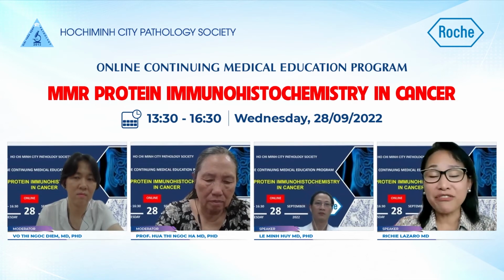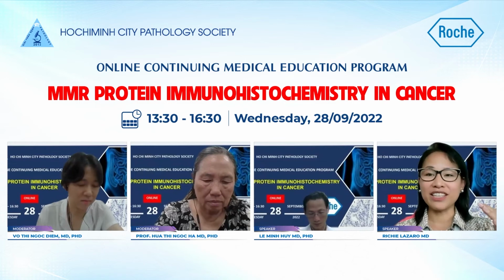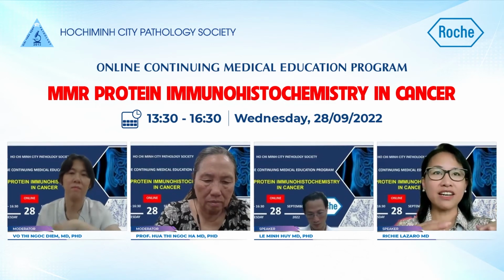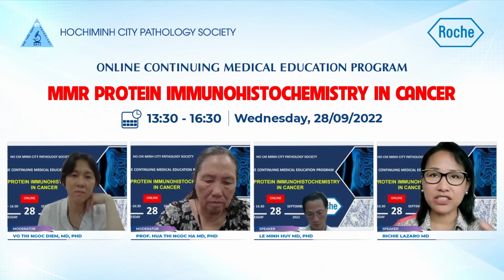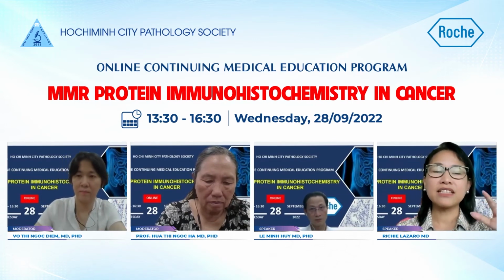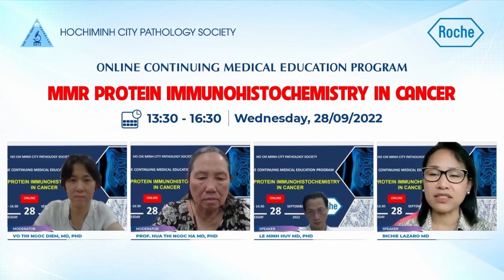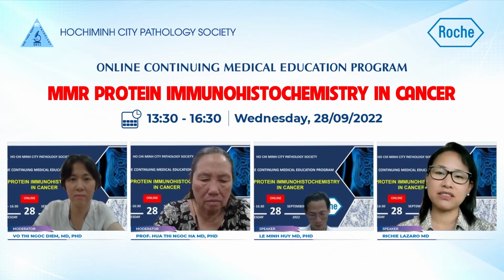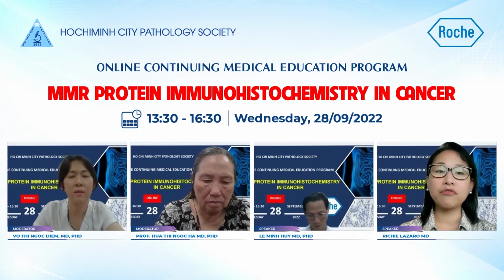How is the fixation process? Is the fixation even, or is the fixation adequate? Because incomplete fixation of the specimen in formalin can sometimes produce patchy staining or focal staining. That's another explanation. So it could be another cause of focal staining.